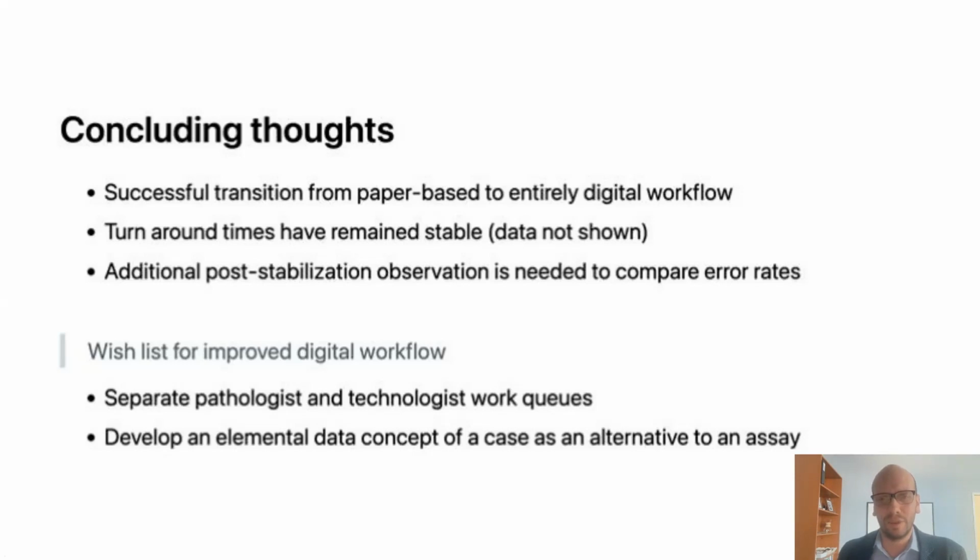We are currently collecting data to compare error rates pre and post, but do not have a long enough observation period post-stabilization as we've been continuing to optimize our strategy. Wish list for improving this process. If any brilliant programmers at Sebia want to think about this for the next version of Phoresis, I would love to see a separate pathologist and technologist work queue such that a case can be assigned to one or the other. This would really help to stay organized as we collaborate to complete this testing.